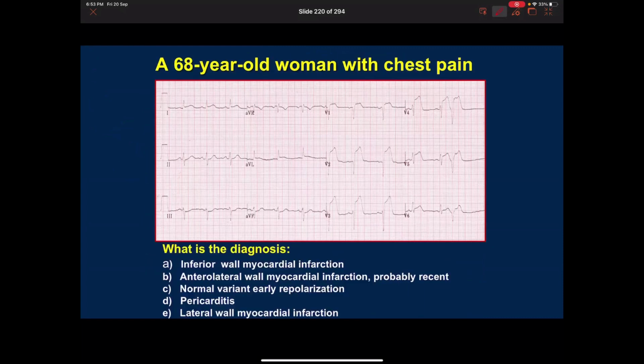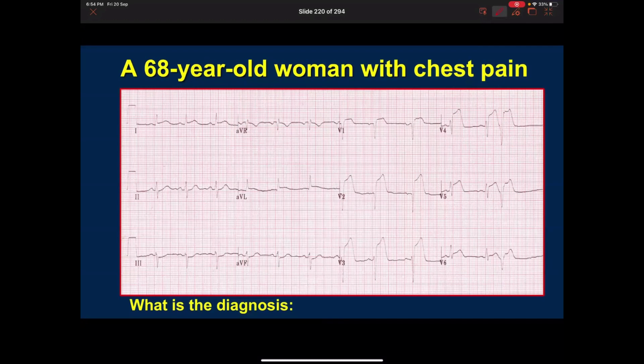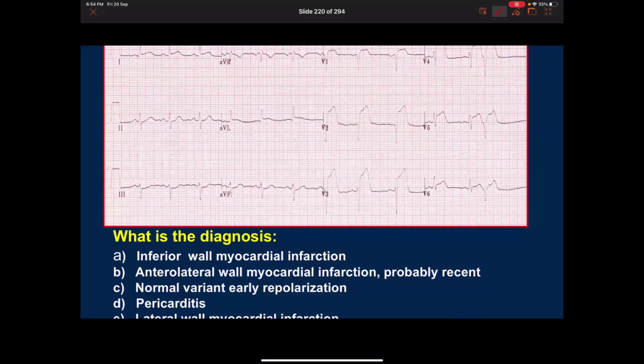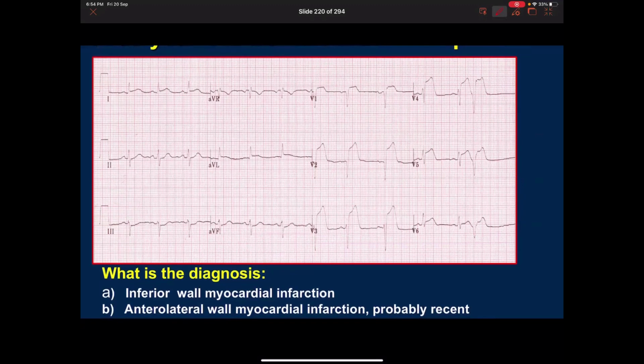Now, this is how questions are gonna come. So who can solve this? You can try, you make mistakes now, it's better than later. I can. Okay, go ahead. So I can see that there is an ST elevation from V2. So it is B. Yes, tell me which leads are affected. From V1 to V6. V1 to V6. Okay, I agree.